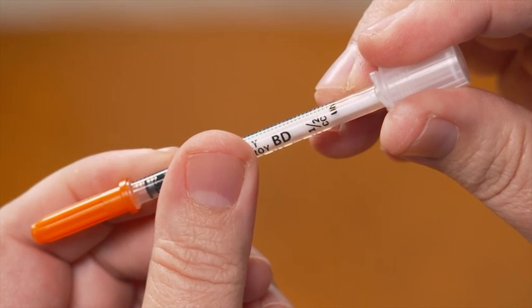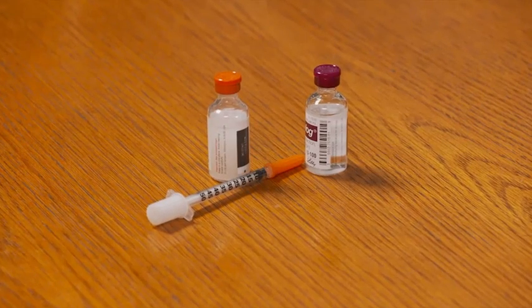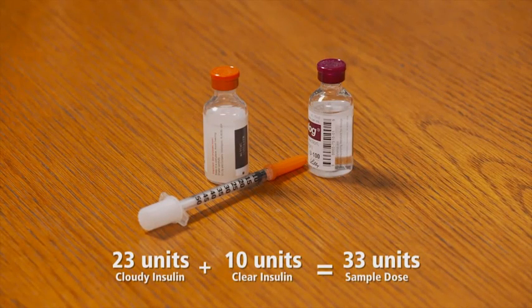For this demonstration, I'll be using a half milliliter BD insulin syringe with the BD Ultrafine 6 millimeter needle, and I'll be mixing two different U-100 insulins: 23 units of cloudy insulin and 10 units of clear insulin for a total dose of 33 units. This is only an example, so be sure to check with your doctor to determine the syringe and the dose that are right for you.